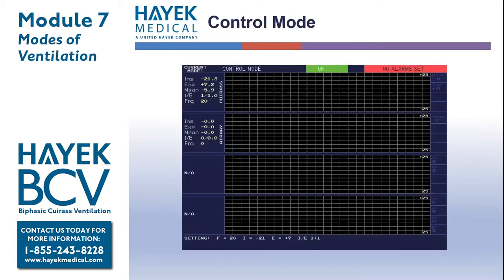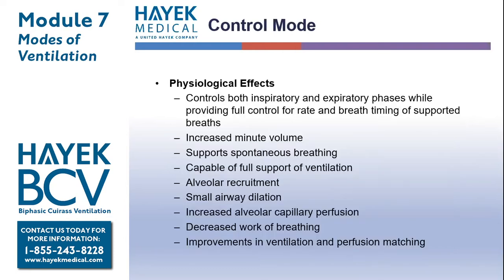Control mode. In control mode, it is a ventilator. We're setting a negative pressure to create lung inflation, a positive pressure to generate exhalation, setting a rate and an IE ratio. It is a non-invasive ventilator. Controlling both phases, inspiratory and expiratory, while providing full control for rate and breath timing of supported breaths.